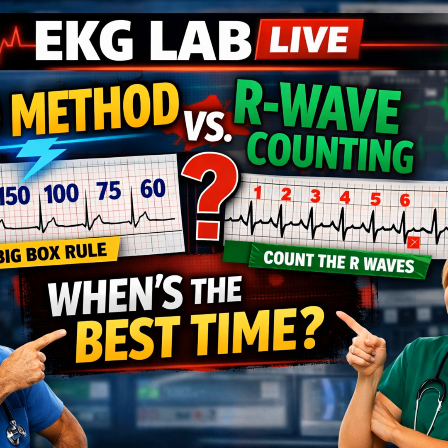That's a great way to put it. We're debating the big box method, relying on that 300, 150, 100 sequence, versus what we'll call the strip method, which is just counting the R waves and multiplying by 6. So the central question is, when does that clinical precision matter more than a quick, holistic estimate? And, on the flip side, when does trying to be a mathematician actually endanger your patient?